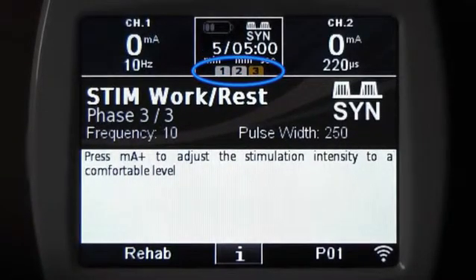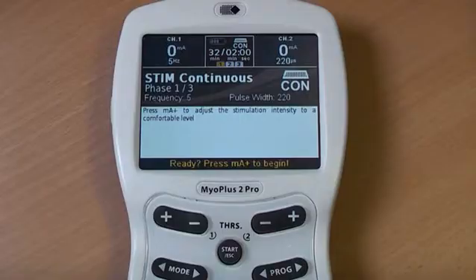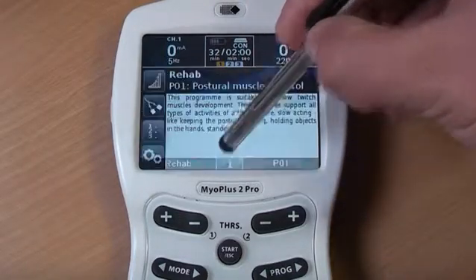To review the phases and select the phase you may require, press the set button repeatedly. For help and additional information, press the I button situated in the middle of the bottom of the screen.